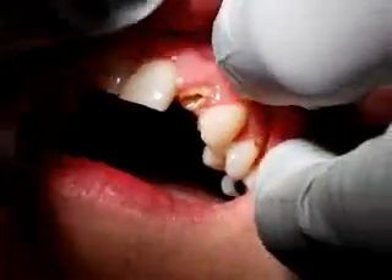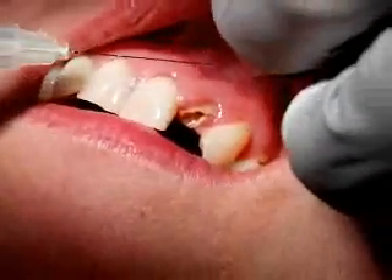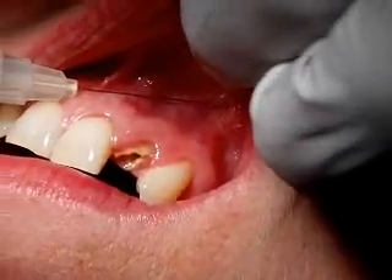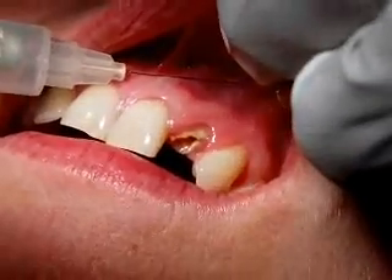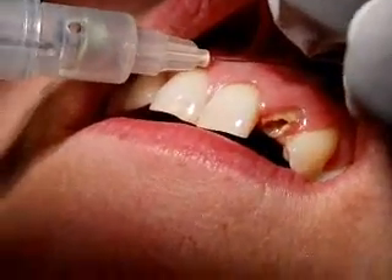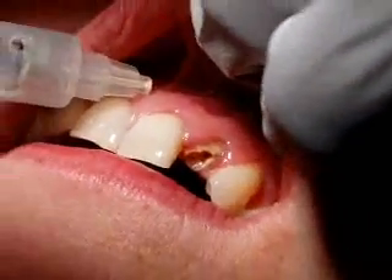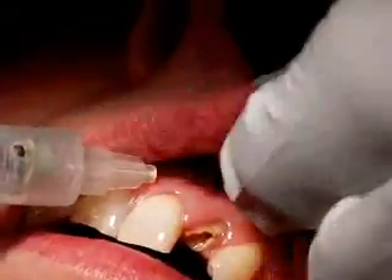So quite often you can be a bit uncomfy in the front of the mouth here. What I tend to do is pop loads of topical anaesthetic on, just place the bevel against the mucosa there, deposit a little bit as I'm then pulling the lip down and over the needle. So it just drops underneath into the sulcus there.